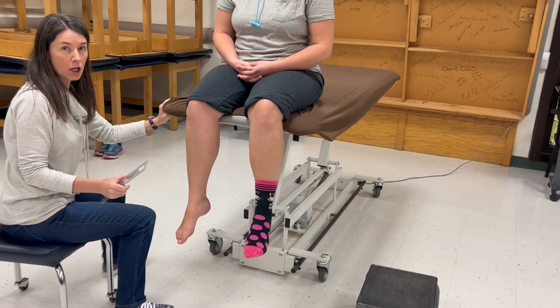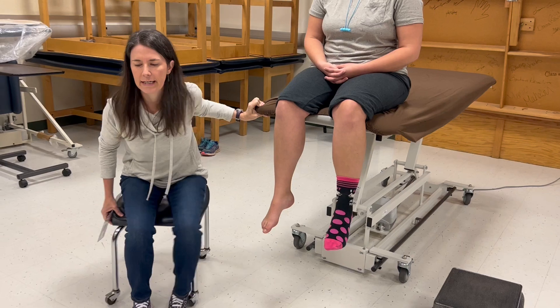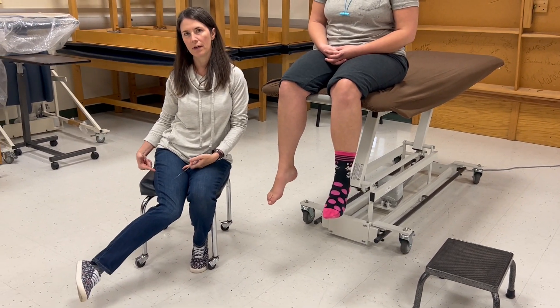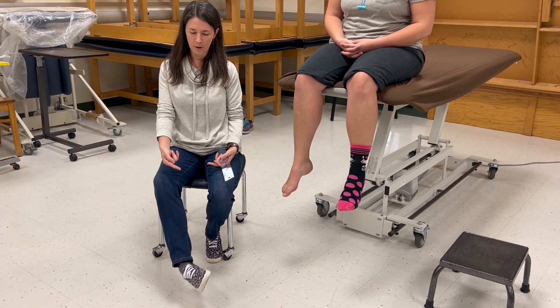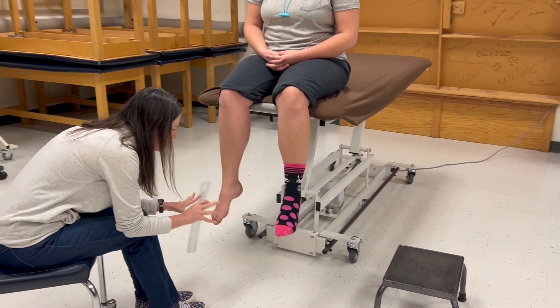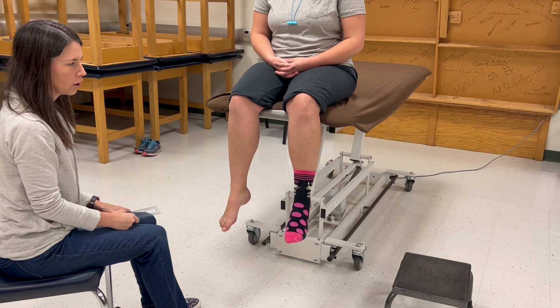Let's talk about compensation. If someone is limited in eversion, you might see hip internal rotation. If someone is limited in inversion, you might see hip external rotation. Try not to be so focused on what's happening at the foot that you miss any hip compensation that could be occurring.